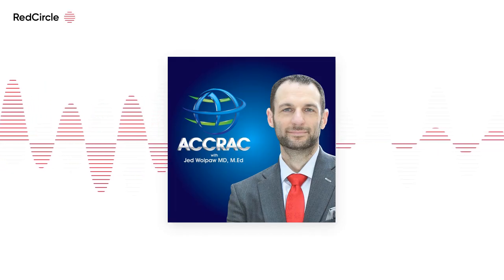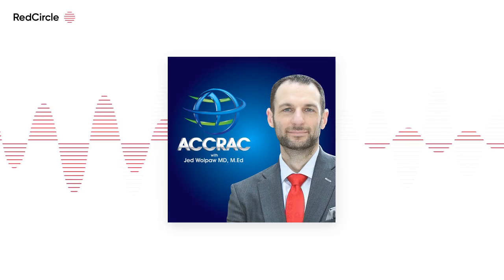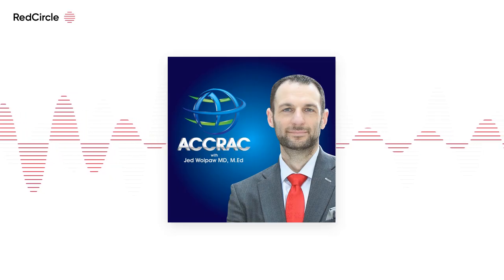So it's just making more accurate your sense of the compliance. Yeah. And driving pressure. There's a huge interest in driving pressure. And if you're measuring driving pressure, you really should be looking at airway closure. Otherwise, you could be documenting extremely inaccurate driving pressures. All right. Great points. Let's talk about esophageal manometry.